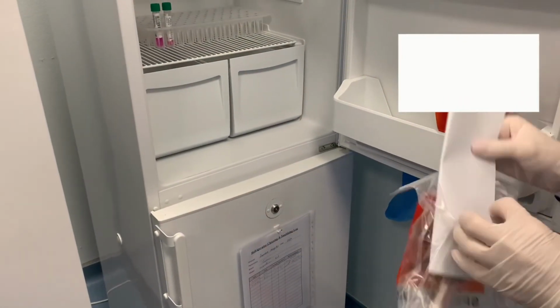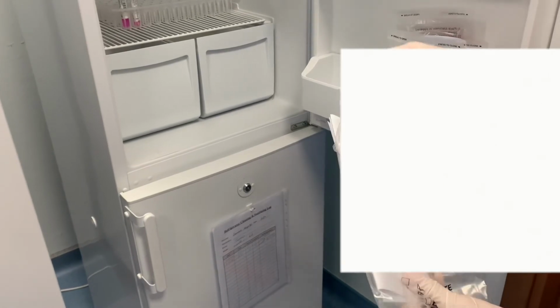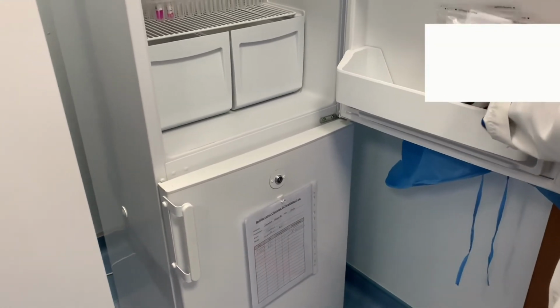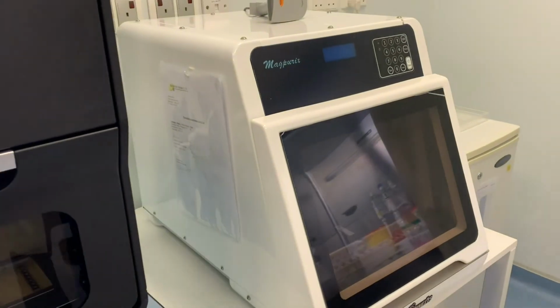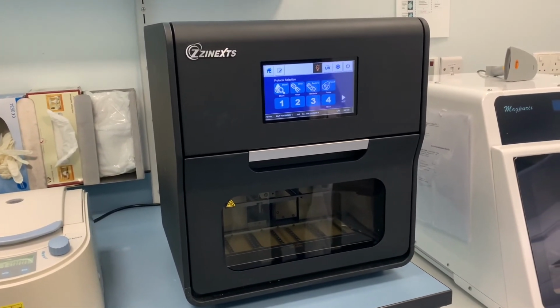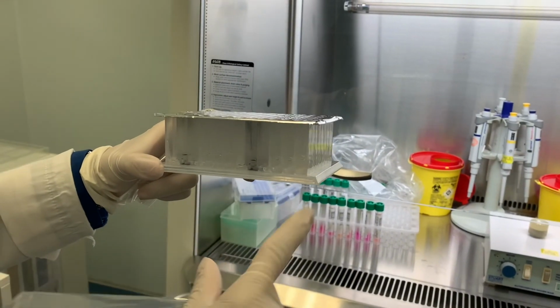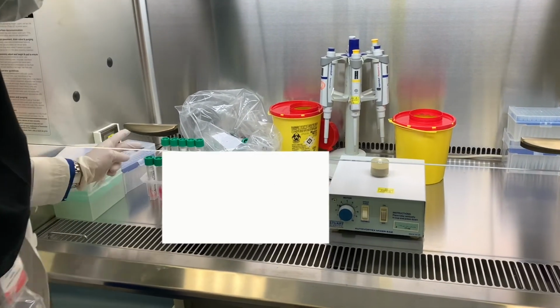The samples obtained from the patients come in these containers with the patient's details on them. They're covered by 2 biohazard containers. Here, we see where extraction is done. It is primarily done by these 2 devices. For extraction to occur, we need to place samples from the patient's PCR into this container.